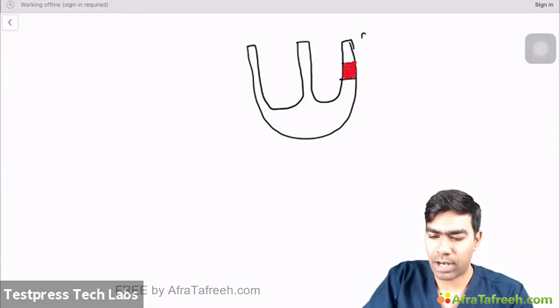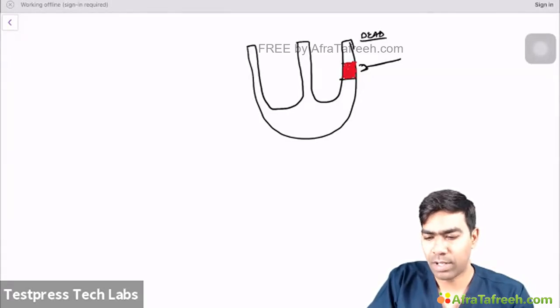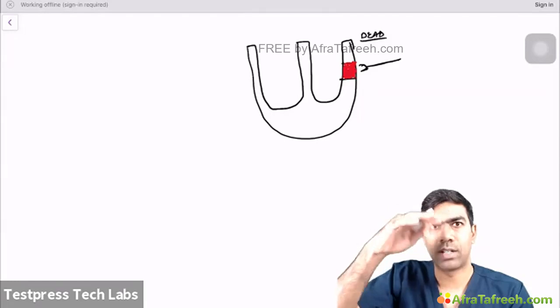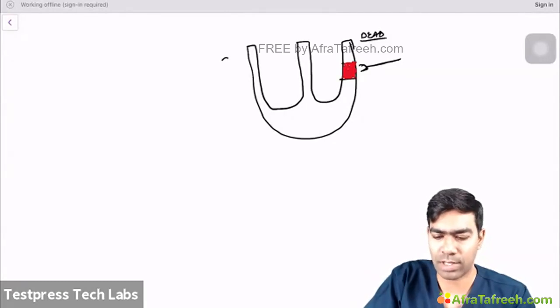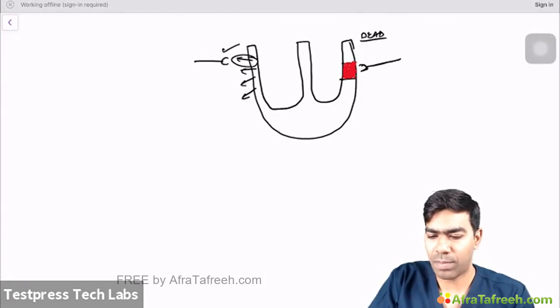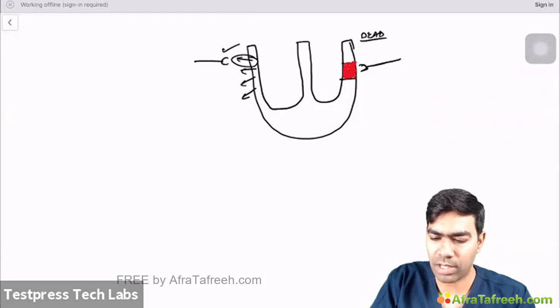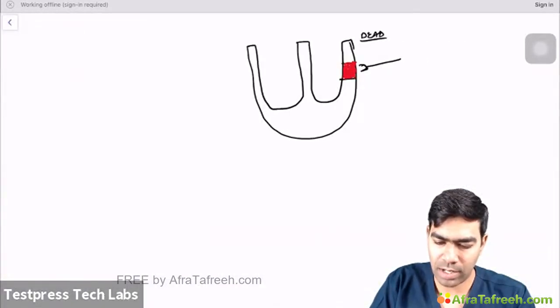So because it's a dead myocardium, it creates a sort of an electrical window over here, which means now this lead we are talking about is not able to see any current over here. So it's trying to see beyond that. Normally it cannot see beyond that. For example, if we take a lead here, if the depolarization is happening in this direction, this lead will detect only this current. And it will not be able to detect what is happening on the other side, because the current that is coming is interfering with your ability to see on the other side.